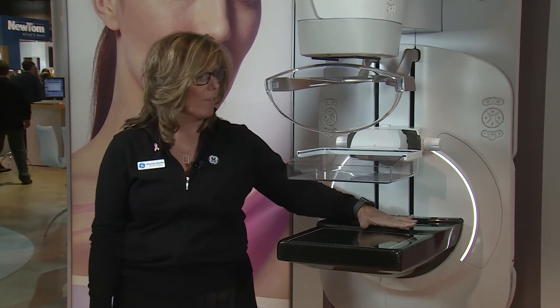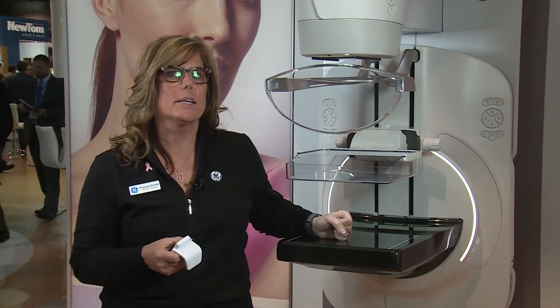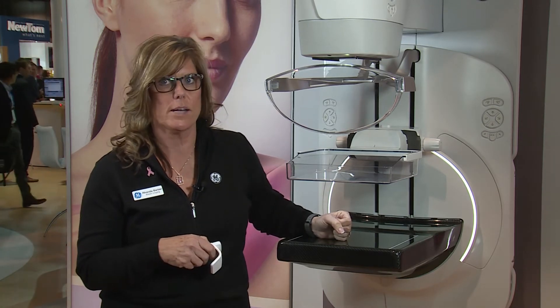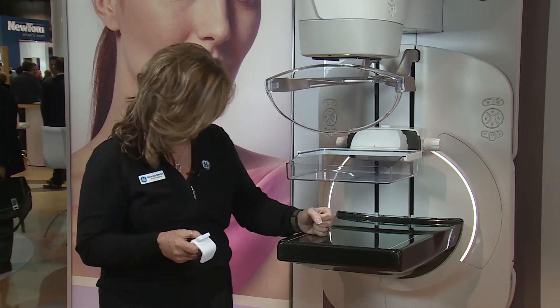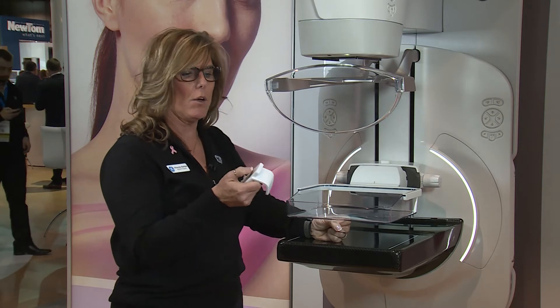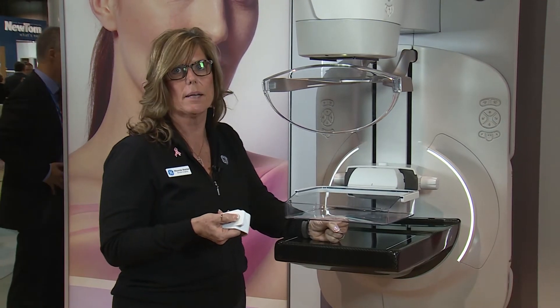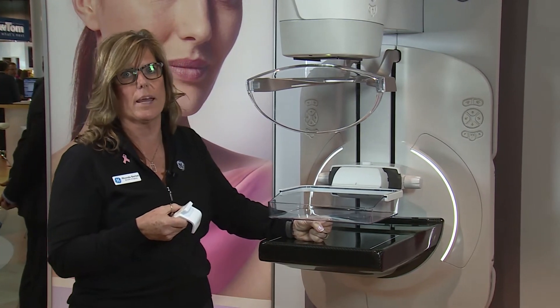For the technologist, we have a larger workspace in the back. We've also introduced Duetta. Pristina Duetta is a duet between the patient and the technologist, allowing both to be in control of the compression. As a technologist, I position the patient's breast, anchor it, and then allow the patient to apply additional compression. The patient can release, but will never release below what the technologist has already anchored.